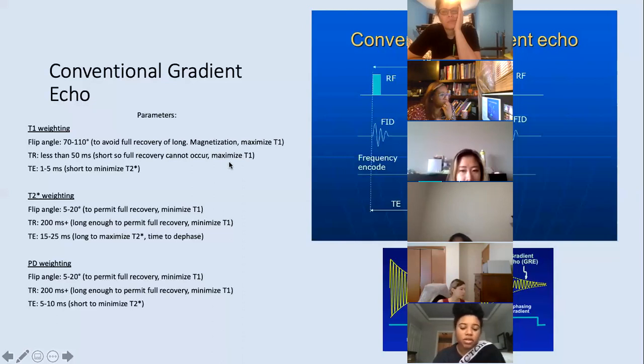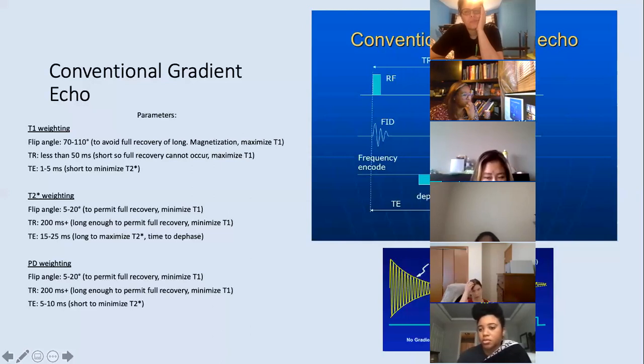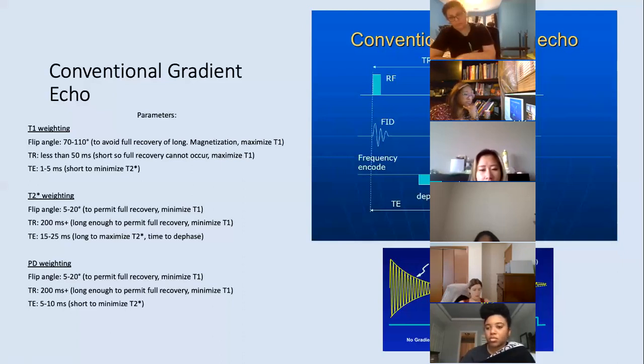What is first level? Because they do choose that one a lot. First level is basically saying, okay, normal level is I'm going to scan at this level and I'm never going to exceed heating up the patient by more than 0.5 degrees Celsius. But if I want to venture into first level, I'm potentially heating their core body temperature by 1 degree Celsius.